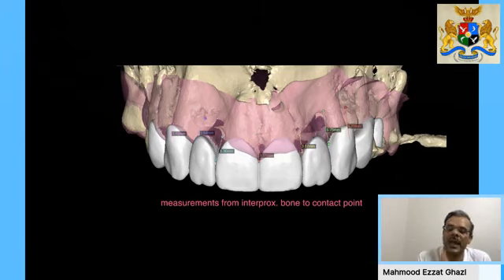Am I going to be able to use an FP1 prosthesis or not? Here we decided to use an FP1 prosthesis. So mostly our implant is going to be placed 3 to 4 millimeters from our new zenith point, or our new gingival margin of each tooth. And this is if we're going to use an FP1. But what if through these measurements we found that we could only use a hybrid prosthesis? We need a prosthesis to be used with pink porcelain or pink composite. We think in a totally different way. The implant needs to be placed at a higher level.